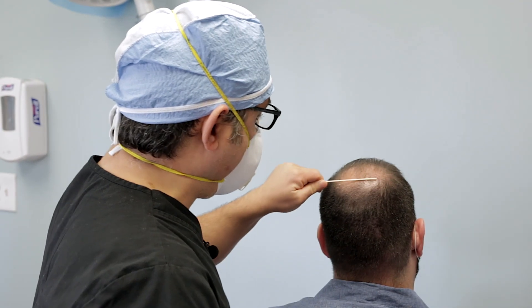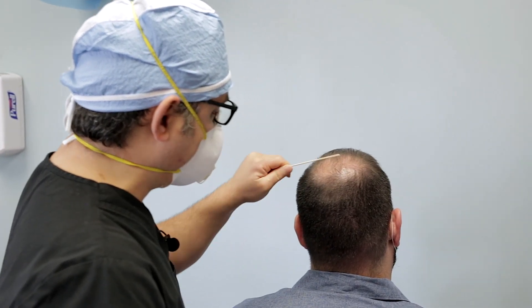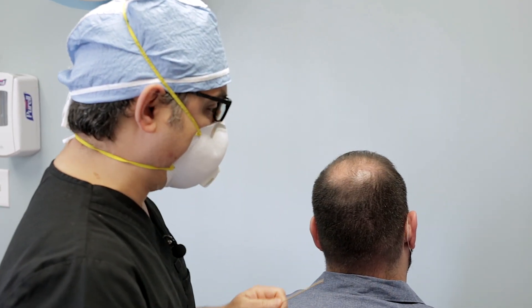Today we're going to be working on the crown area and we're going to put about 2,000 to 2,500 grafts in the crown.